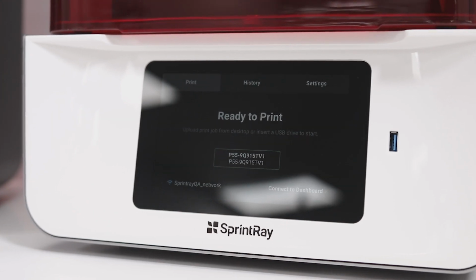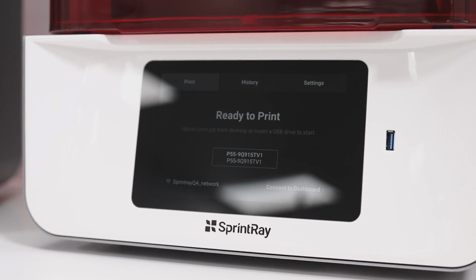So whenever you have one printer, you're going to be quickly forced to either take longer to do your jobs or buy a second printer. Now, the biggest indication in 3D printing for the dental office is in-office aligners, and in-office aligners require a lot of models to be printed. Even though the 95 is a very fast printer, when you're printing 6 to 12 models at a time, your printer is going to be tied up for some time. So buying a second printer is usually the way that doctors go.